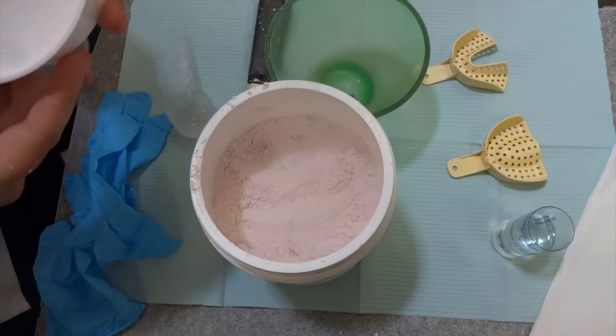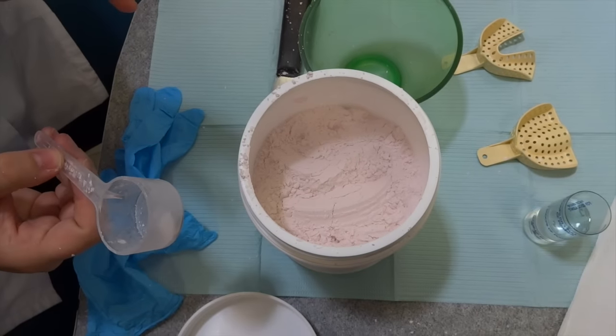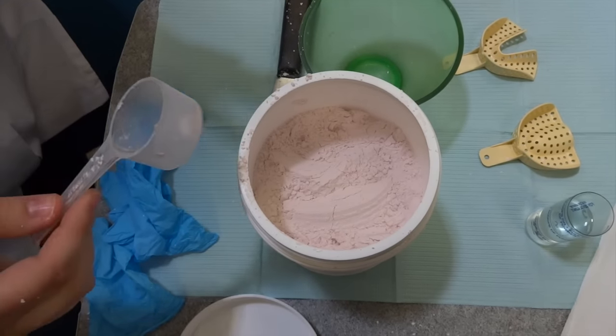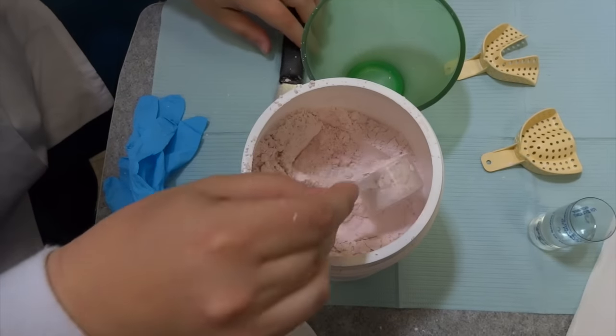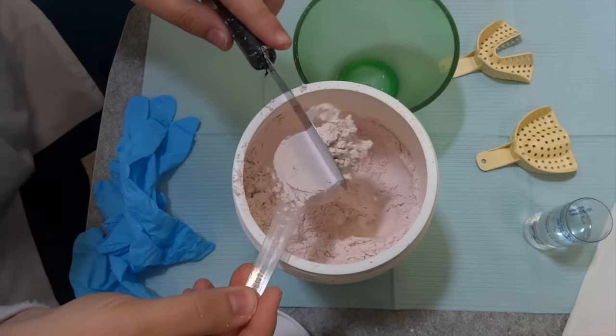The next thing you want to do is always make sure you use the scoop that comes with it. A lot of hygienists and assistants just go off what they feel is right, but that honestly will make sure your mix is not right. So always use your correct scoops and your water container.